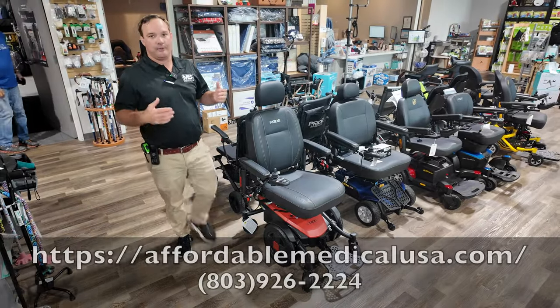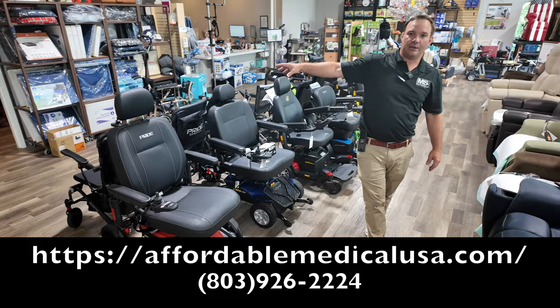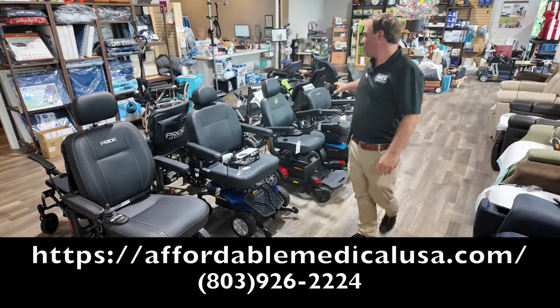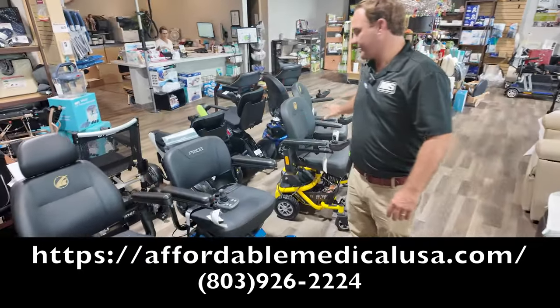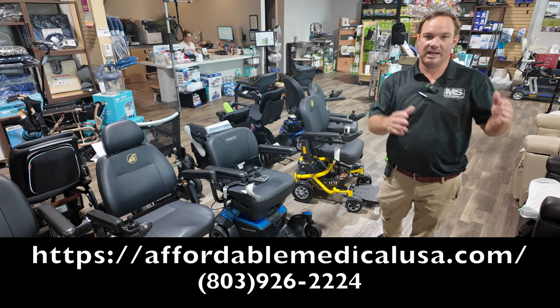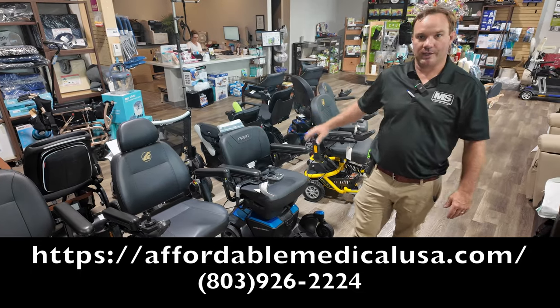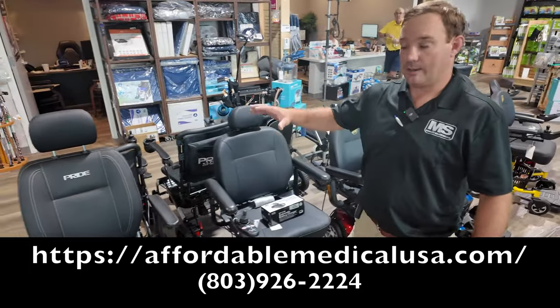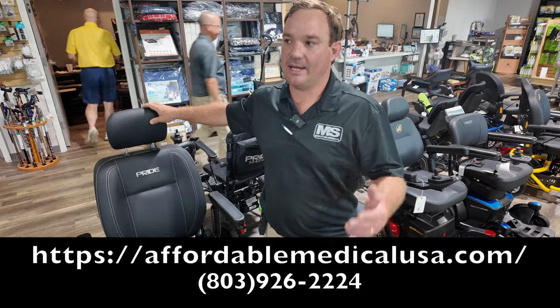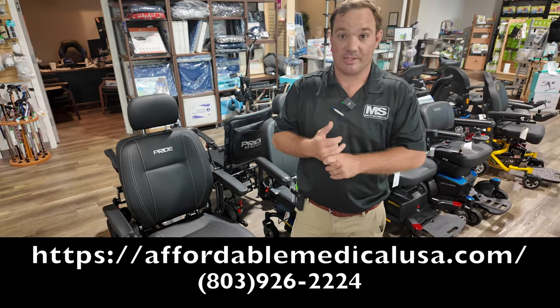Out of all the chairs I just showed you, this is a good video to understand the differences between chairs. If you're going to be putting something in your car all the time and can pick up 40 pounds, you'll probably like a fold-up power chair. If you're only putting a chair in the car once a week, you'll probably like a disassembling chair — they have a slightly stronger motor. Figure out what your primary use is: usually a power chair is more for inside, but you also want to go outside.